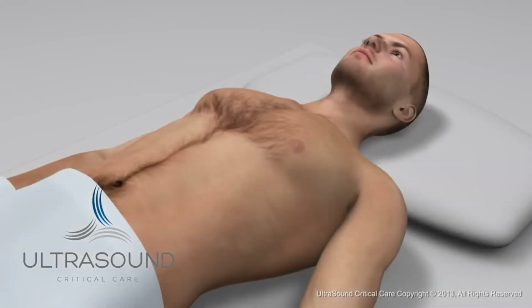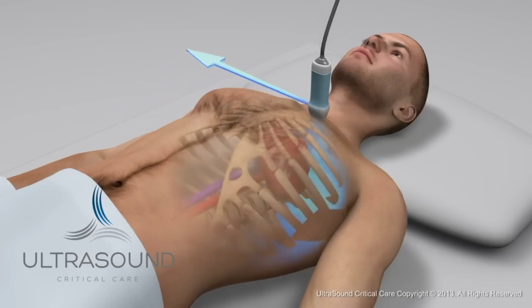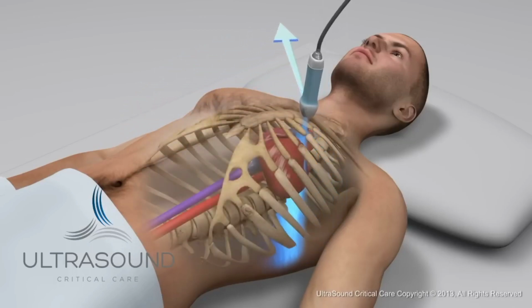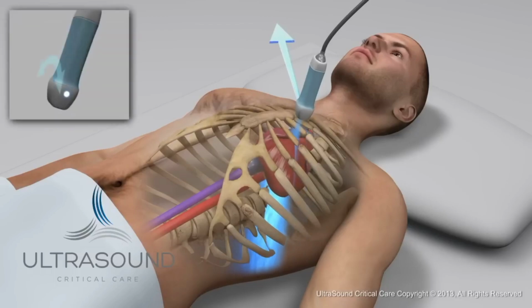The parasternal long axis view. Begin by placing the probe at the second intercostal space at the left sternal border. The dot will be pointing in the direction of the patient's right shoulder. Scan down the left sternal border until the image comes into view. You may need to tilt or rock your probe to obtain the best image.